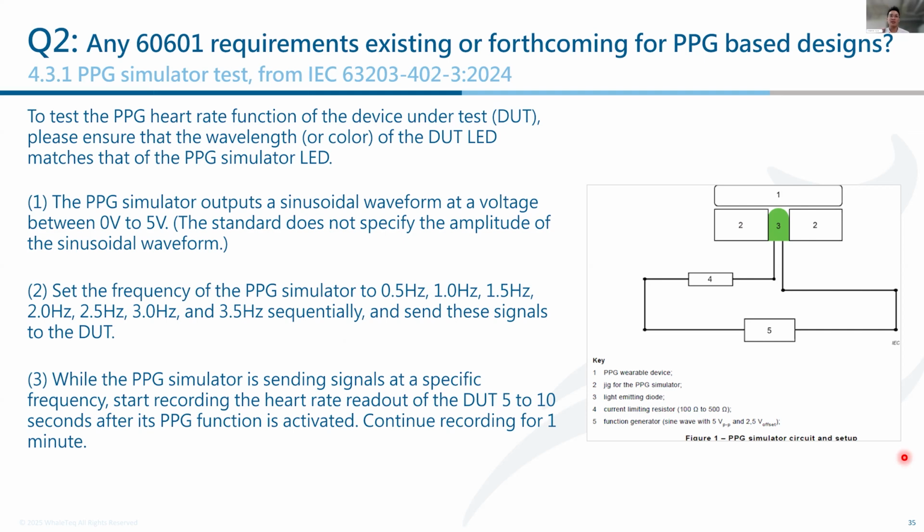So we will separate it from 0 to 255. This is how our PD measures your LED. So you can compare your currents and make some correlation. And maybe that helps you to determine your power efficiency. I think this is the best I can think of for you. So the short answer is that we can output our PD detection raw data for you to qualify your power efficiency, and compare it with your LED drive currents.